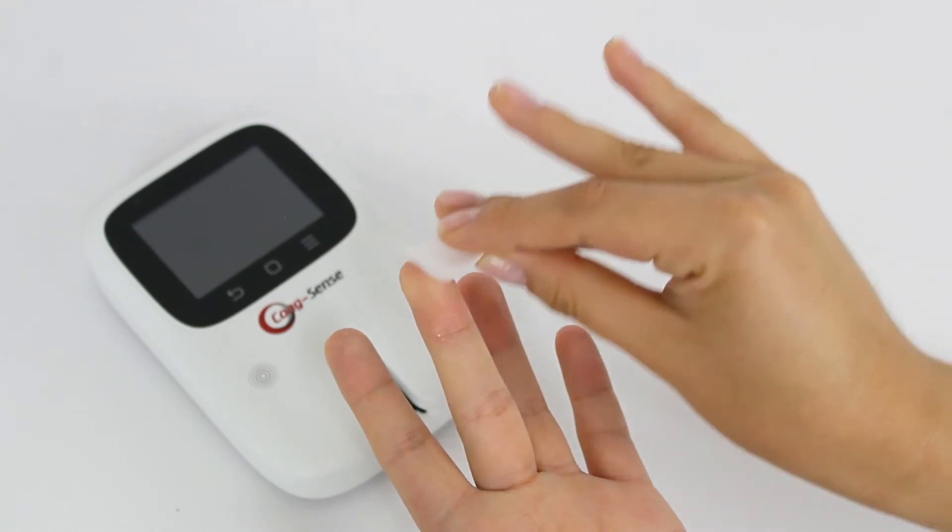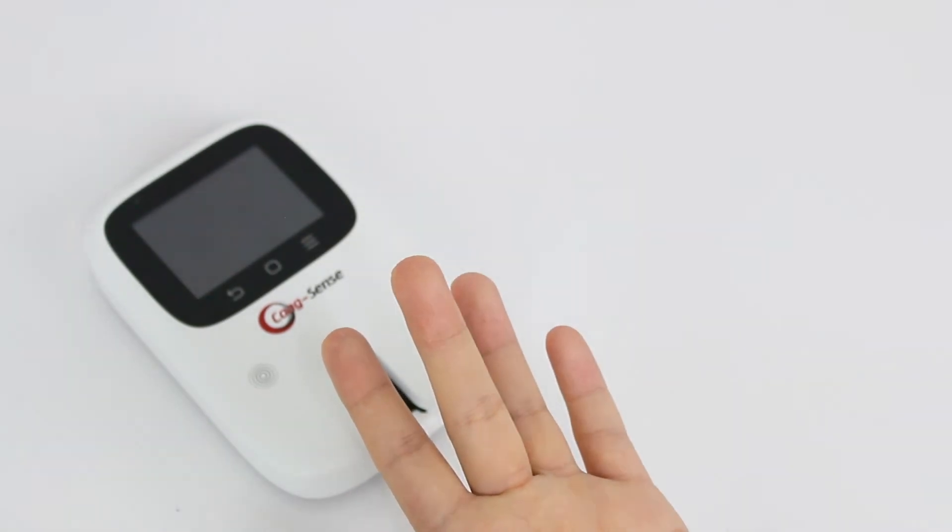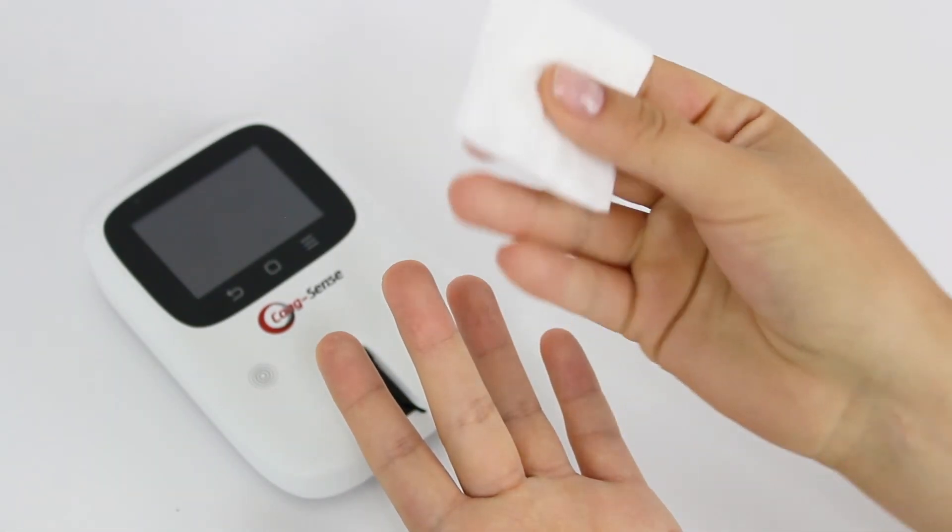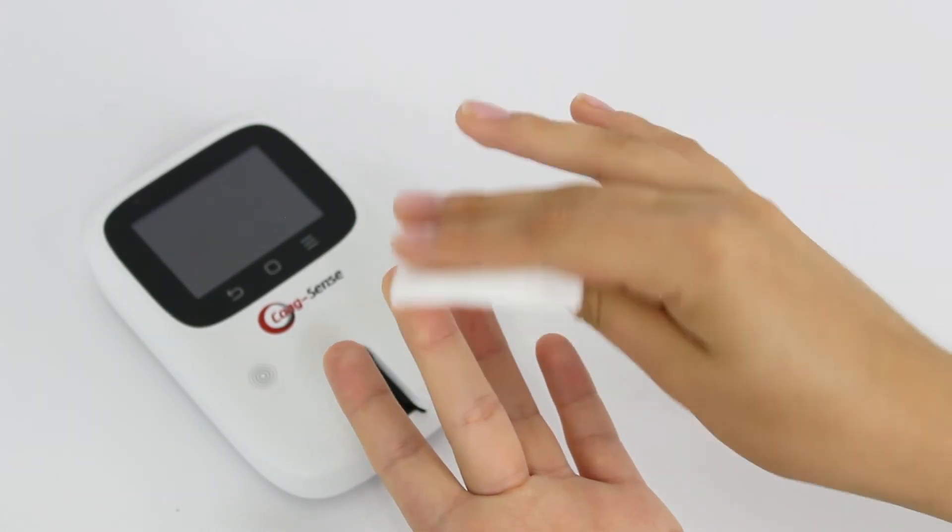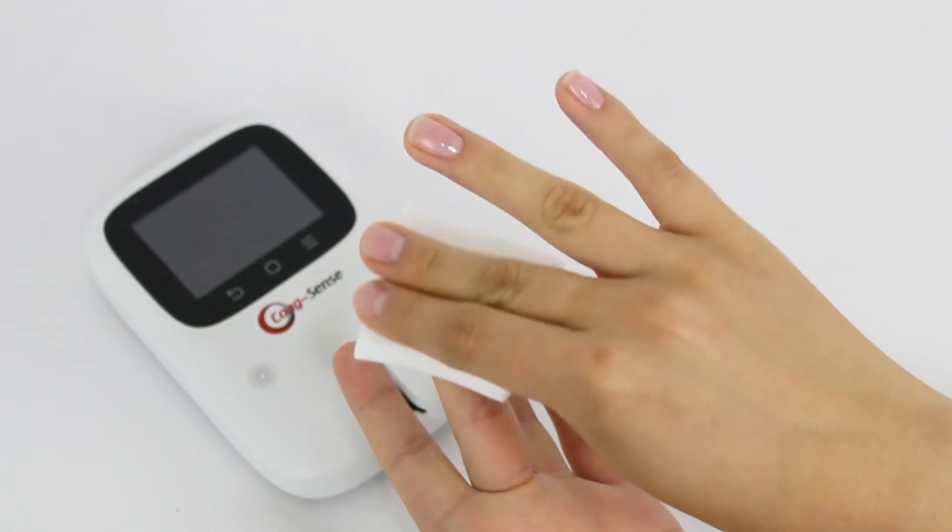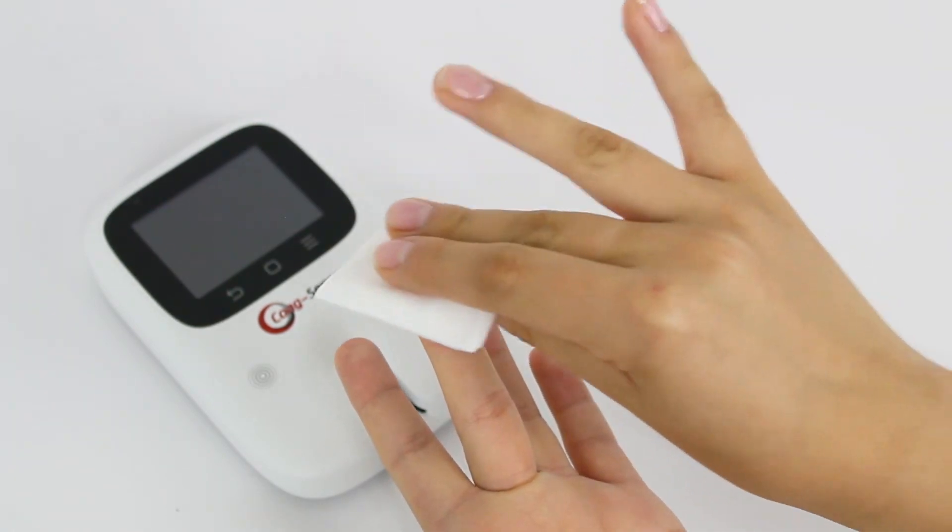If an alcohol wipe is used, the finger must be completely dry as residual alcohol will affect results.